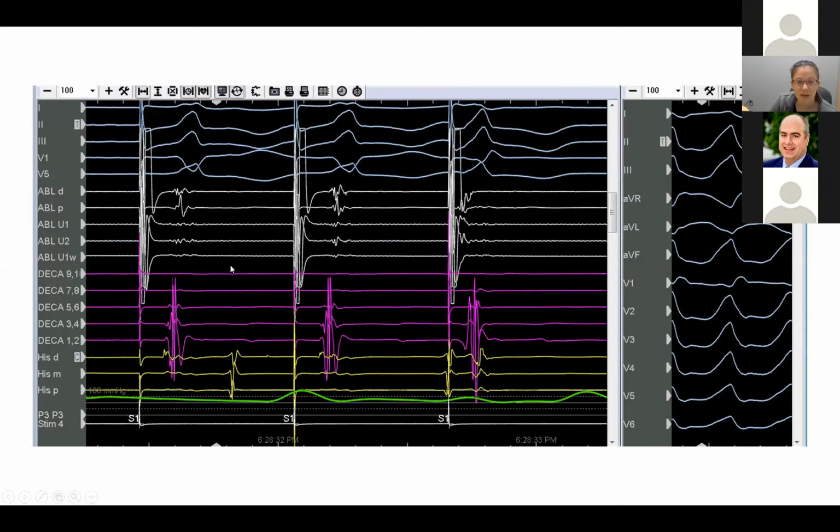Looking at the intracardiac electrograms here, you can see that when we're pacing, there's a part of the signal that we're not capturing when we get the left bundle morphology beats. Here we pace, there's a little bit of delay, and you see this stuff that's not captured. But when we get the right bundle beats, these are actually captured. So it could be that different components of the late potential are playing a role in the two different VT morphologies.